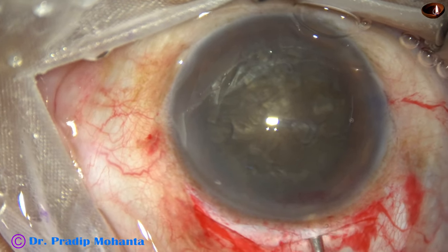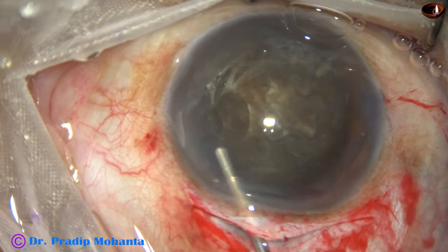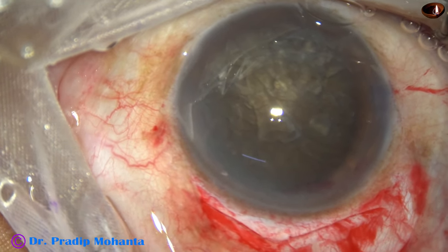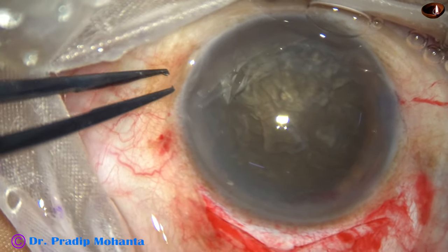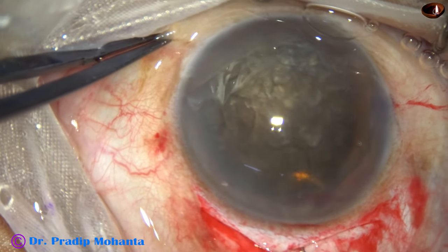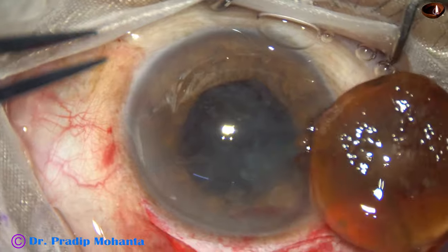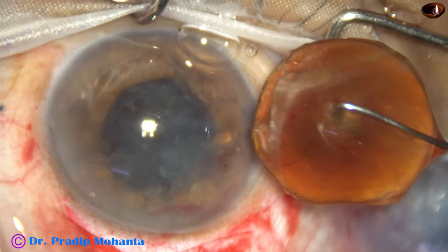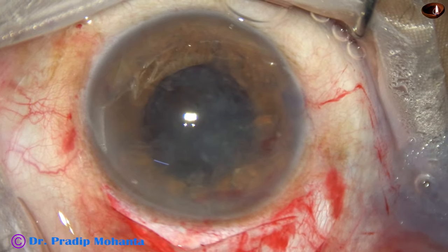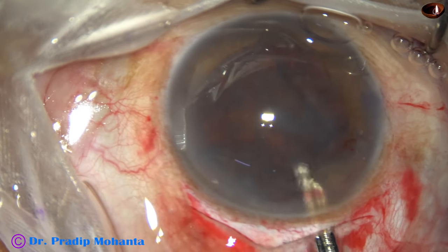Now we have to protect the corneal endothelium. We must inject an adequate amount of viscoelastic in front and inject some viscoelastic behind. This is a fish hook made from a 30-gauge disposable needle. It goes in at a slant, then is rotated 90 degrees and the nucleus is hooked and brought out. When the wound is adequate, this is a very good technique, but if the wound is not adequate, this fish hook is not recommended.